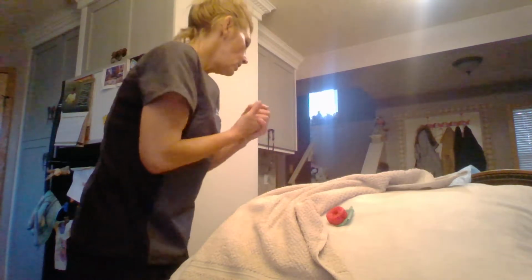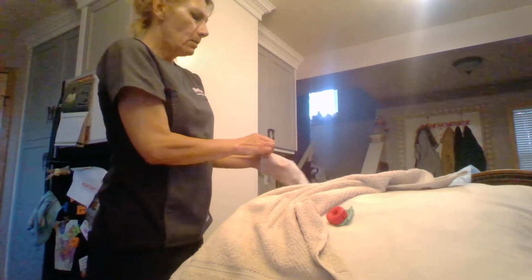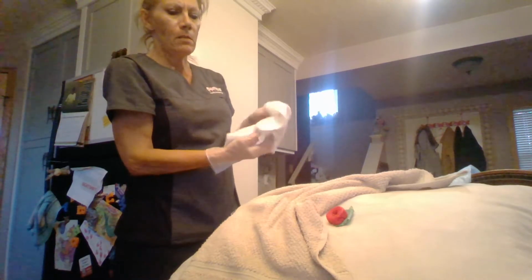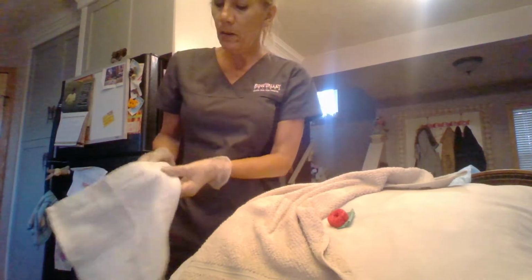We're going to take a soft cloth with just water. We don't want to use any soaps or any alcohol-based items. They could possibly dry and irritate the skin. We would not want the soaps to interfere with the adhesive from the system. You can take a soft cloth. Once you clean this area, you can use a soft cloth, or you can use gauze. I'm going to switch this to my other hand because it's my stronger hand.